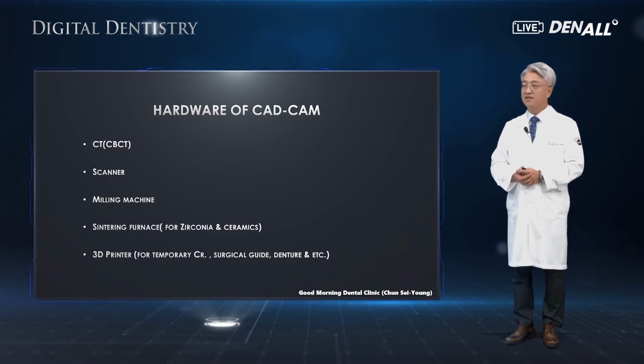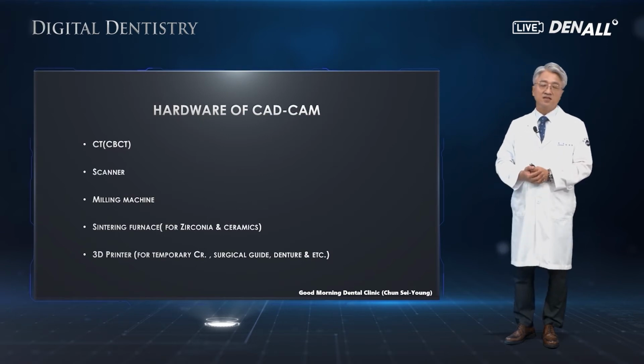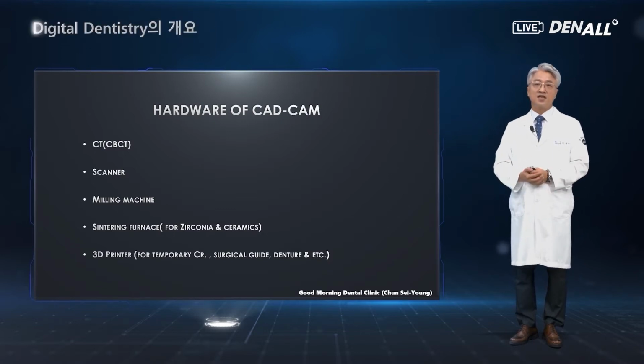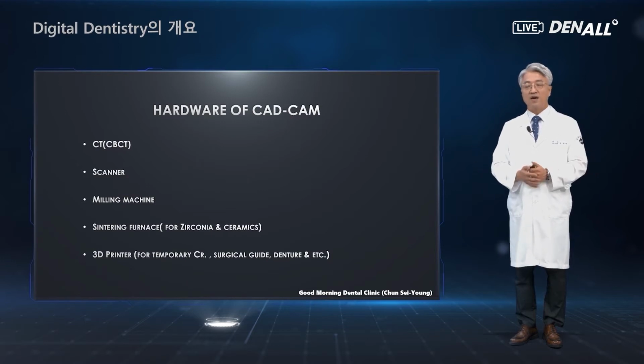A sintering furnace is used. Only recently, 3D printers began to be used in dentistry as the prices have gone down quite considerably. With the development of the technology, the scope of use of 3D printers is expanding from the industrial area to many areas in dentistry.